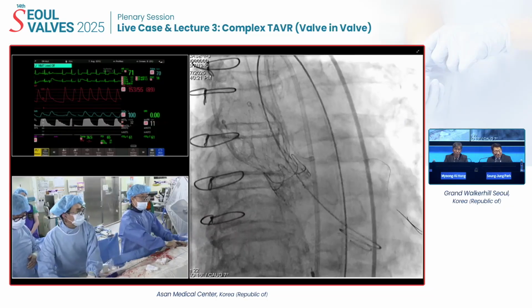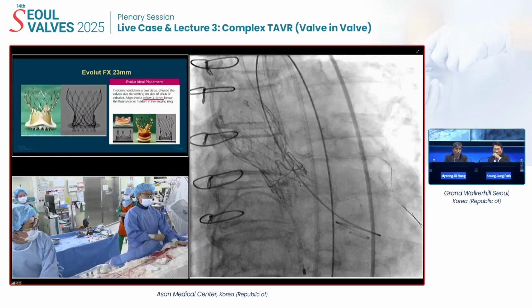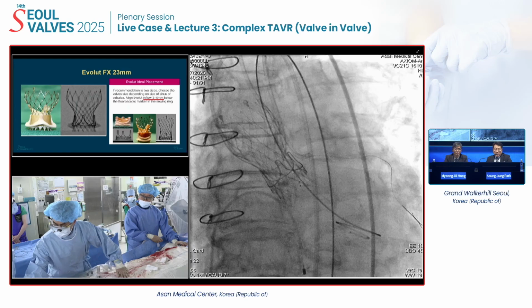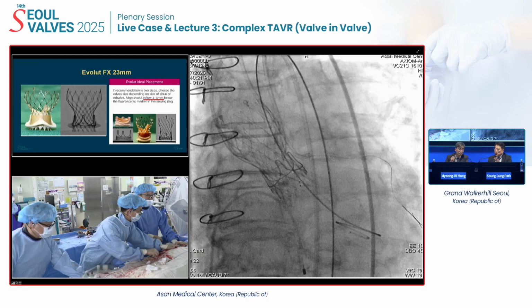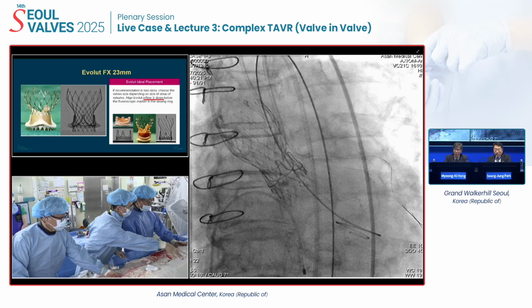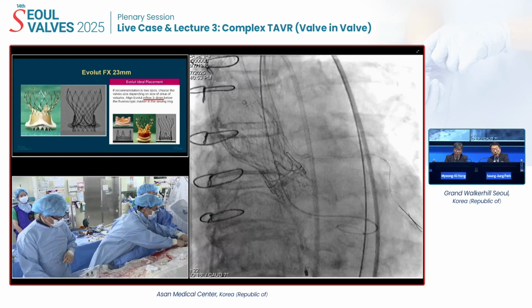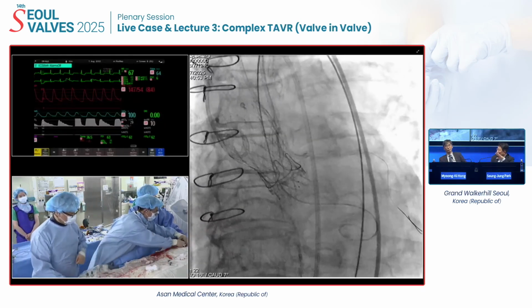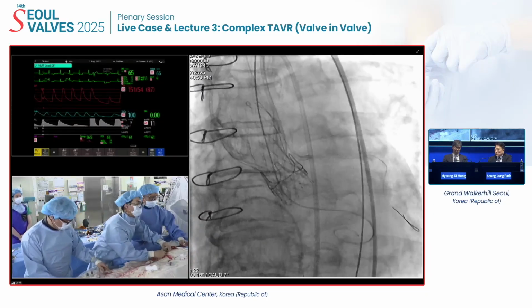오케이, 자. 3, 1, 2, 3, 1, 2, 3. Great. 자, 이렇게 I think position-wise, I think it's almost perfect, right? Especially the reason why there are surgical valve here and the Evolut device a little bit deeper, I think it doesn't matter in terms of any permanent pacemaker, PVR, and also if you get the upper part of the device, it is a larger lumen for the coronary access, something like that, and so a little bit deeper, I think it would be more safe.